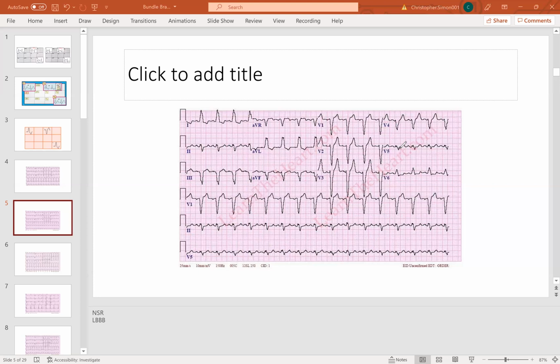If you're still a little confused as to what the criteria is, maybe just get that picture out and hold it side by side while you're looking at these rhythms, okay? That's what I would advise until you kind of commit it to memory. Because there's just going to be some things, guys, that unless you memorize it, you're really going to struggle with identifying things, okay?